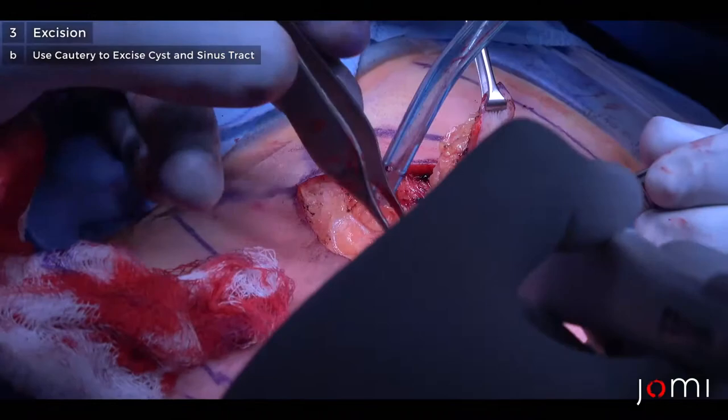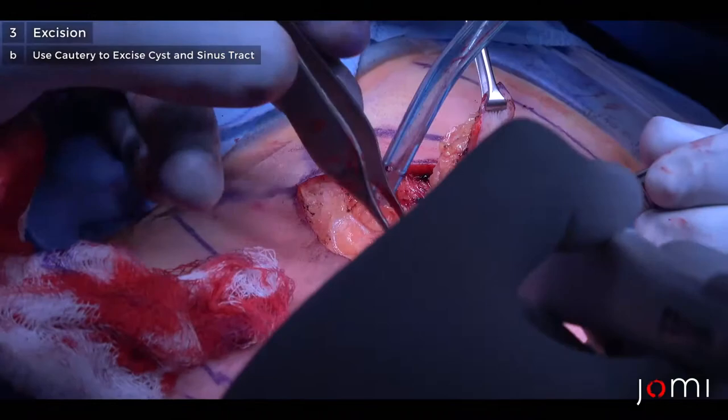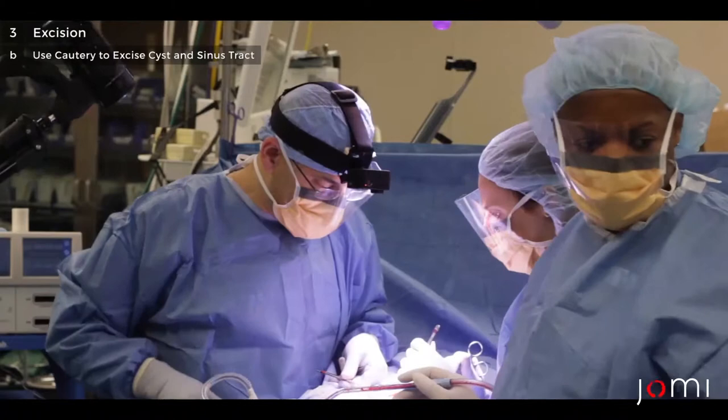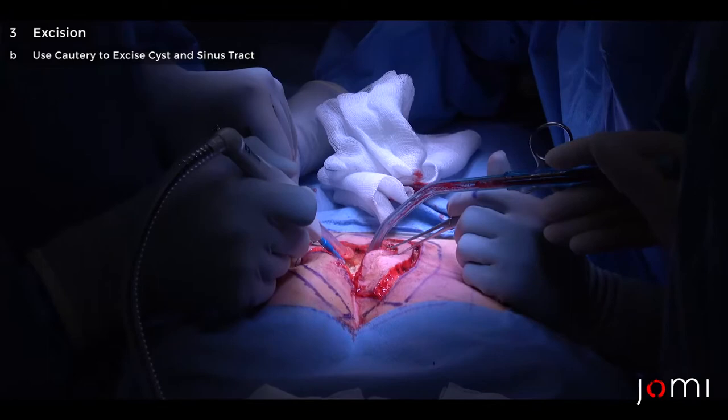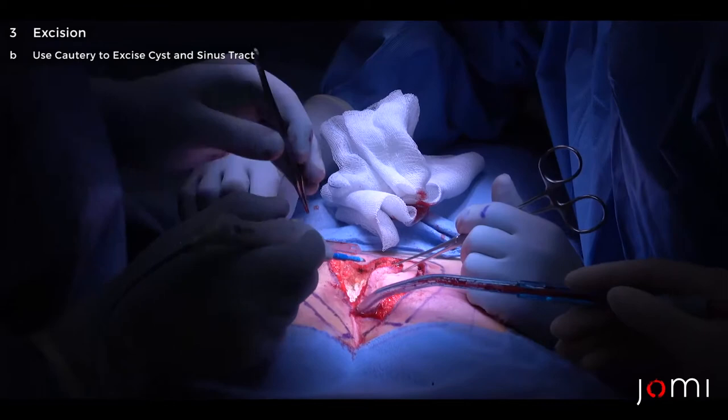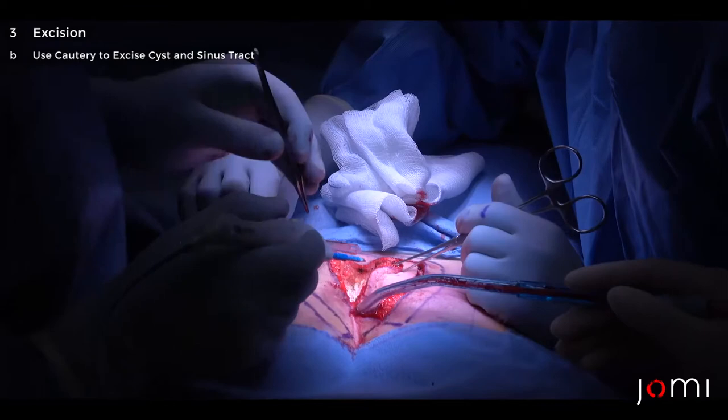This is good from an educational standpoint — we've got a little bit more complicated than I anticipated because of the recurrence, and so I'm just opening up widely to get us into nice healthy tissues. Over here it's a little hard for me to tell whether we're looking at scar — maybe an army navy even a little bit more.